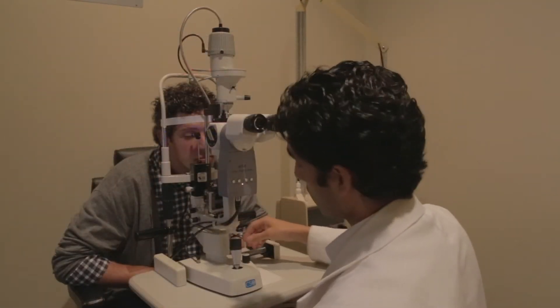Common pitfalls include compressing the eyelid, which causes artificially high pressure measurements. If the patient is not looking straight ahead — if they're looking to the side — that will also artificially increase pressure readings. Too much or too little tear film causes thicker or thinner mires, which introduces artifacts. Ideally, have just a small amount of tear film and no pressure on the eyelid to get an accurate measurement when the two semicircular mires line up with their inner edges touching.